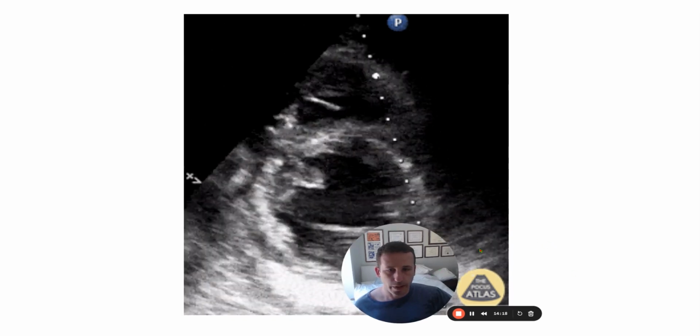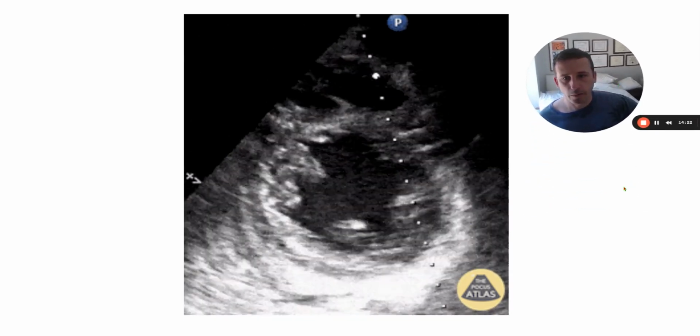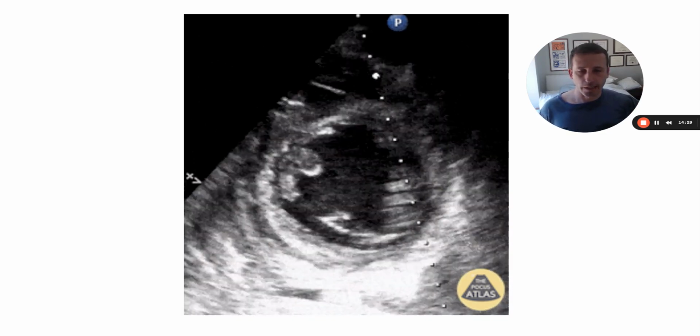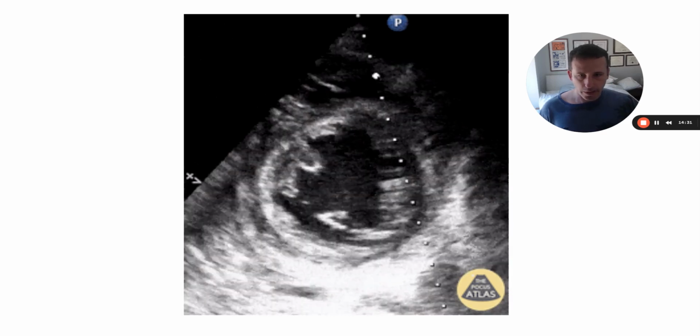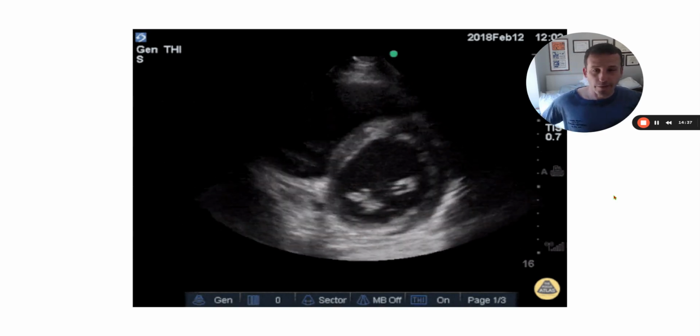Here's an example of a grossly abnormal heart. It's not so much squeezing really in a coordinated fashion as undulating. So this was a patient with sepsis and pretty severe acidosis. Acidosis impairs that myocardial action, and you wind up with reduced EF. Here's a really low EF also.